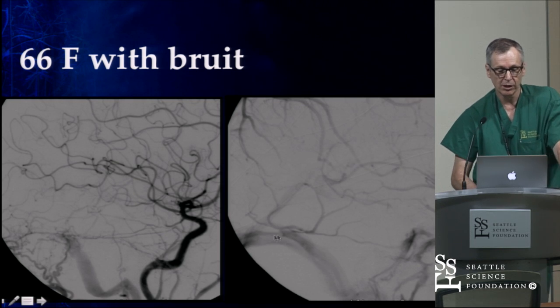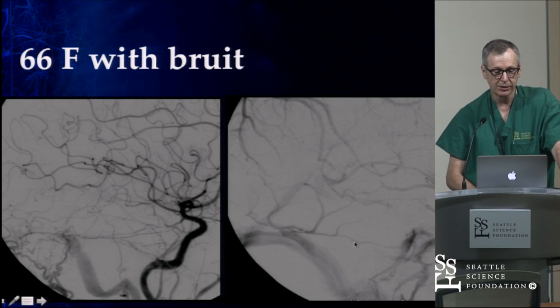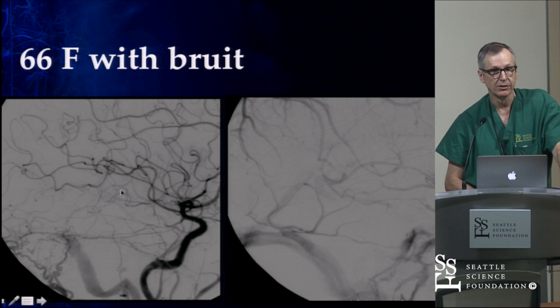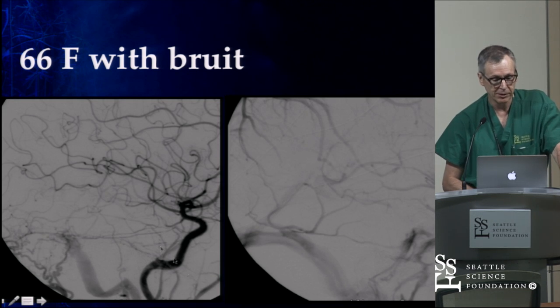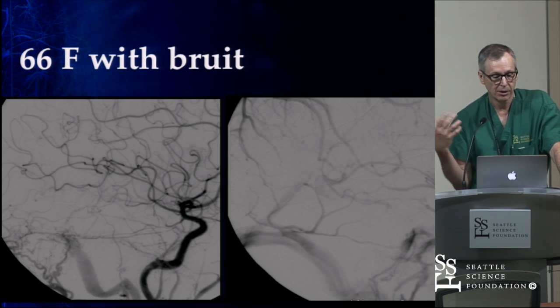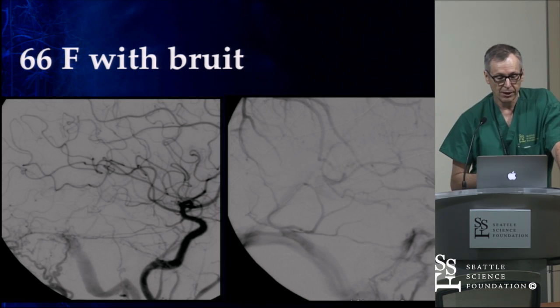That's low risk. We're not seeing any abnormal veins here. So we've got the sinus fills here. We have no veins in the early phase, no cortical veins in the early phase. So if it's high risk, you'd already be seeing those dangerous veins. So this lady, as I said, her symptoms were mild. She's got no high risk features.